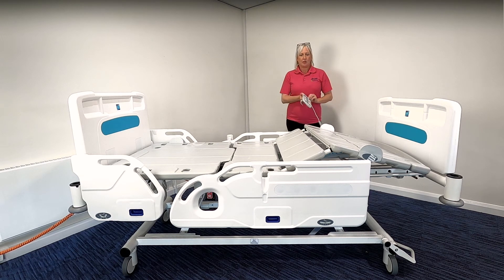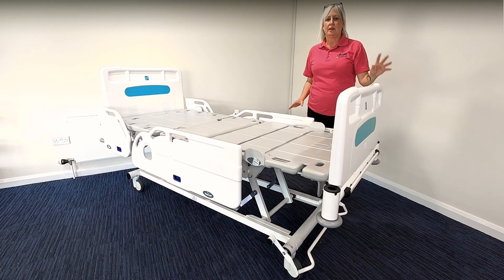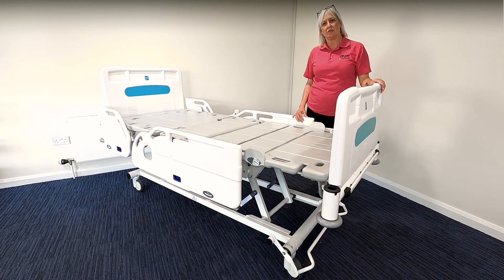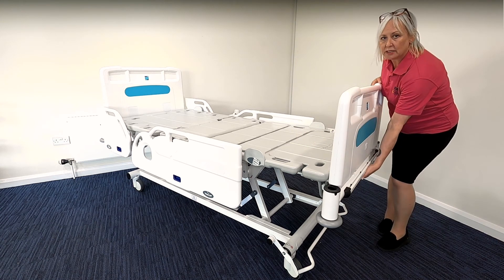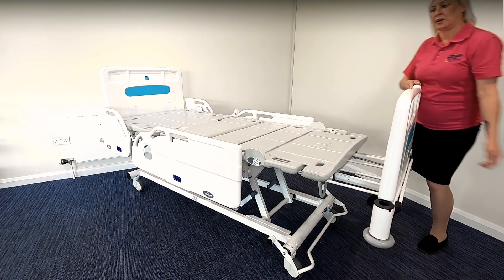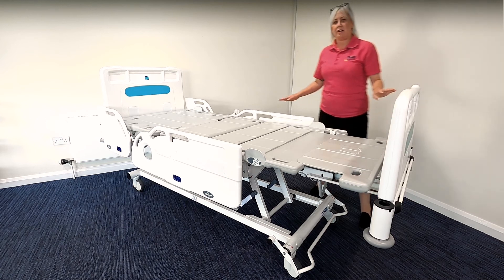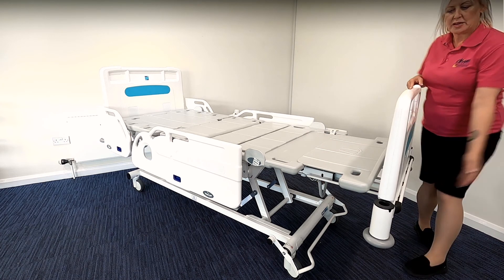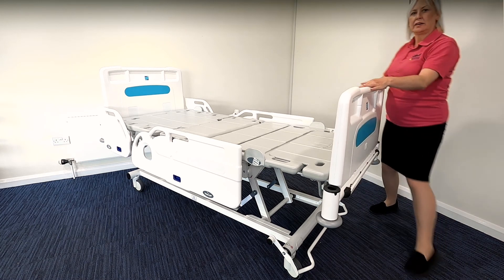Finally take the knee break down and the bed base is now flat. The IQ bed also manually extends by an additional 20 centimetres and this is to accommodate patients of up to 205 centimetres. To extend the bed you simply pull the lever found here and pull the bed out smoothly to increase the bed platform. Then slide the platform down and you have an extended bed. To take the bed back to its standard size, repeat by pulling the lever and smoothly push the bed back to its standard length.